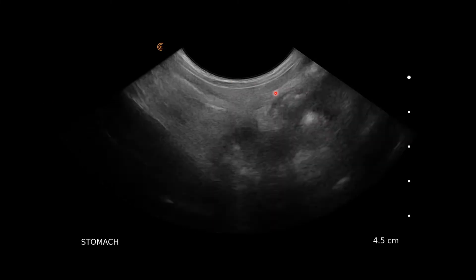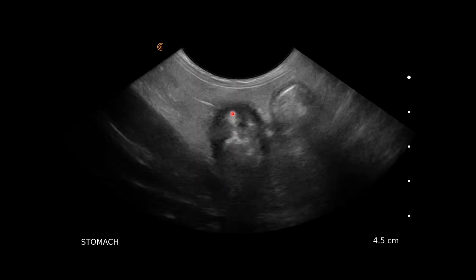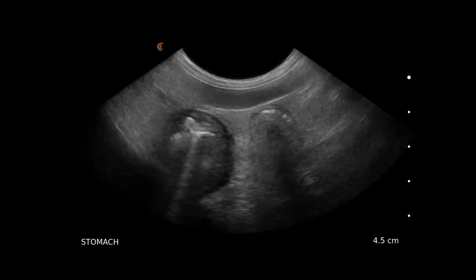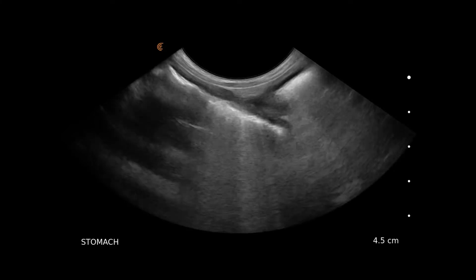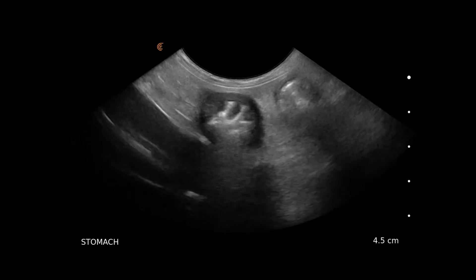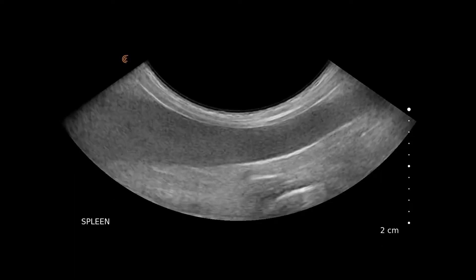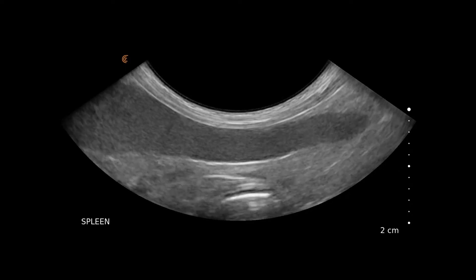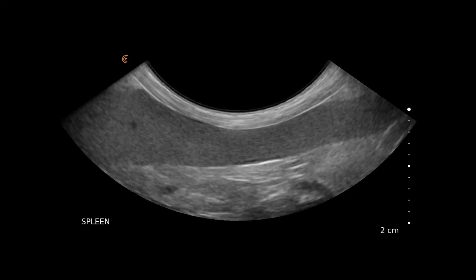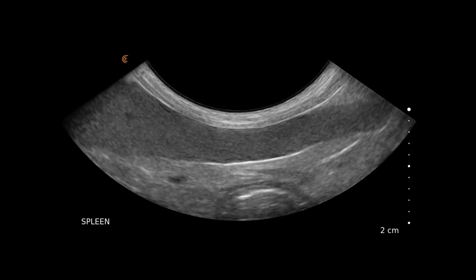Another view of the stomach showing some rugal folds, fanning down towards the pylorus. Here we have the spleen with some splenic vessels — a much more homogenous structure than the liver. Looking up towards the splenic head, moving down the splenic body — the spleen looks very normal.